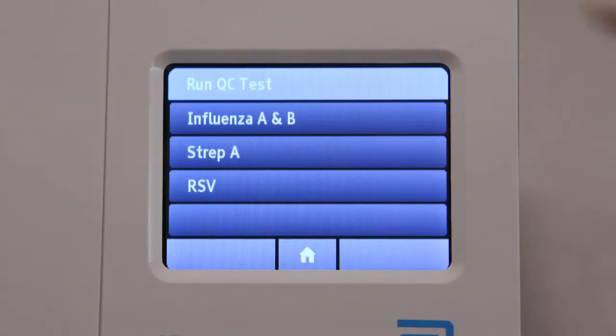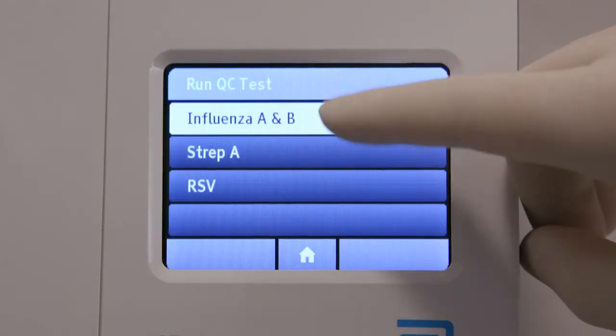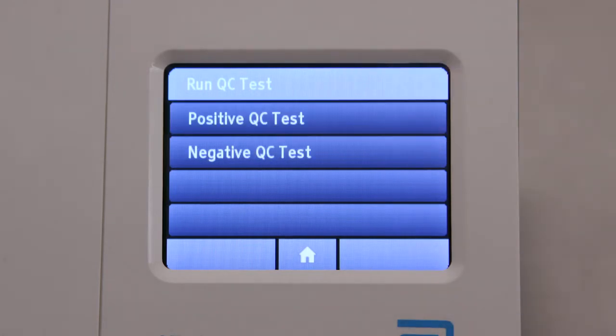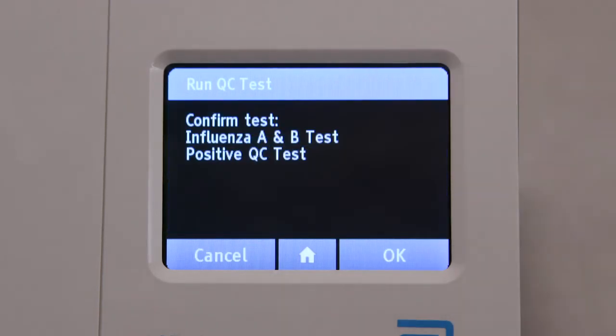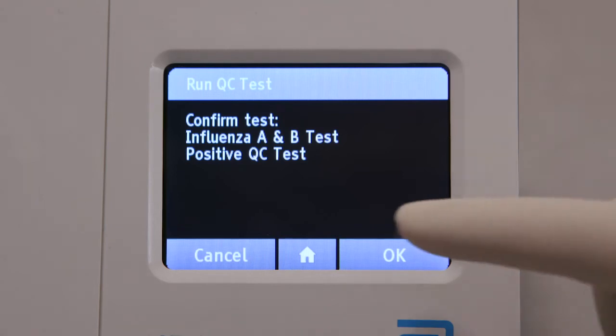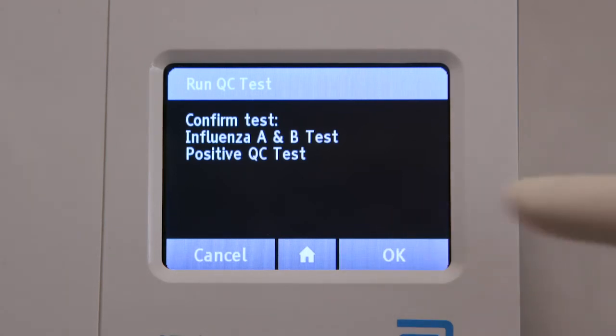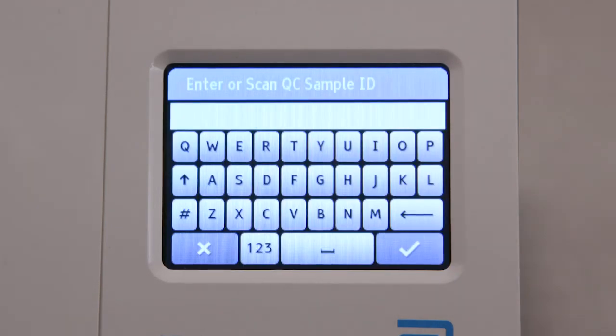Select the desired assay from the list of available assays. Then select a positive or negative QC test. Confirm the test by selecting OK.